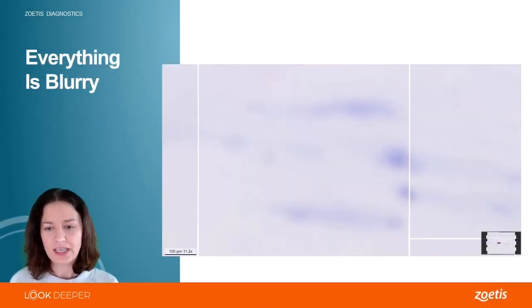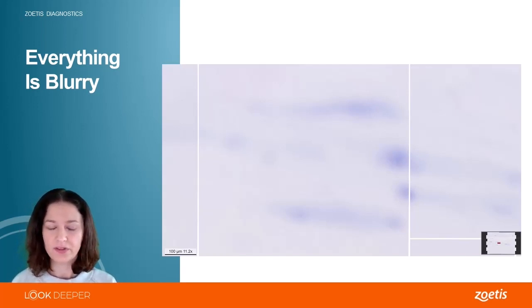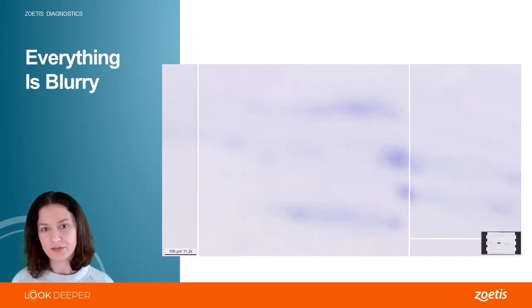Sometimes what we get is a scan that is just blurry. We know that there is sample there. I can see it. It's stained nicely. It's a lovely lavender color. It's spread across the slide, but I can't see anything. So on my end, this is usually what it looks like when there are multiple cover slips present. Those little thin guys are sticky, so they do tend to stick together, and you can inadvertently put two on top. Or this will also happen if the slide is flipped upside down.